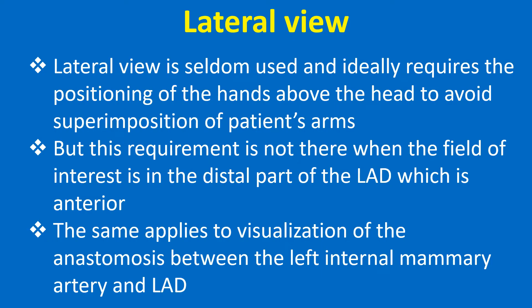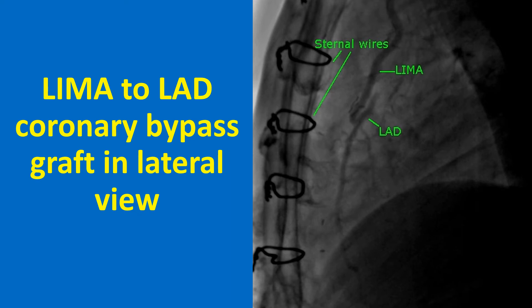The lateral view is seldom used and ideally requires the patient's hands to be positioned above the head to avoid superimposition of the arms. This requirement is not necessary when the field of interest is the distal part of the LAD, which is anterior. The same applies to visualization of the anastomosis between the left internal mammary artery (LIMA) and LAD. A LIMA-to-LAD coronary bypass graft in lateral view is shown; the image has been darkened by post-processing to better visualize the vessels. Since injection was into the left subclavian artery near the LIMA ostium, contrast density was lower than a super-selective injection. The sternal wires indicate post-sternotomy status, distal flow into the LAD is good, and retrograde flow from the anastomotic site into the proximal LAD is also seen.